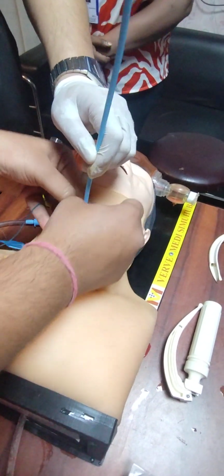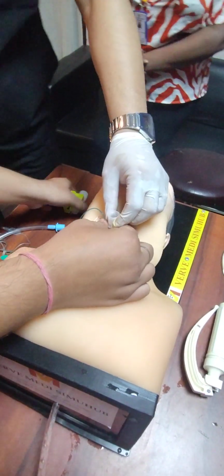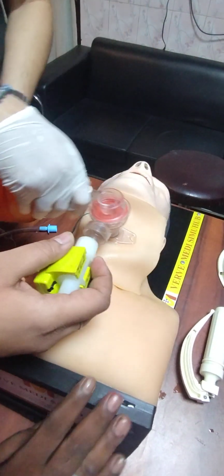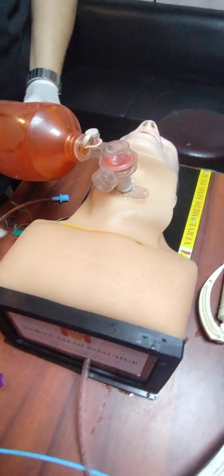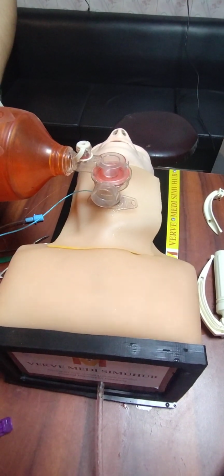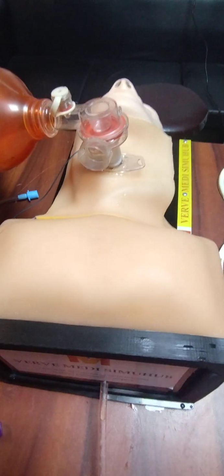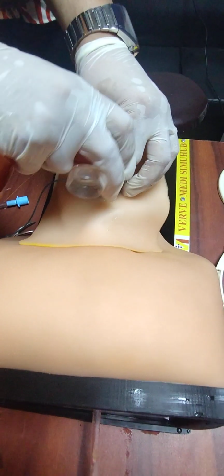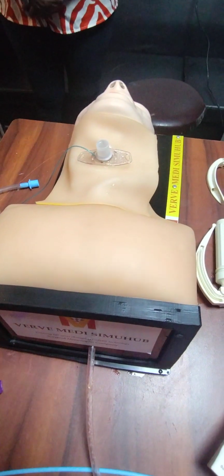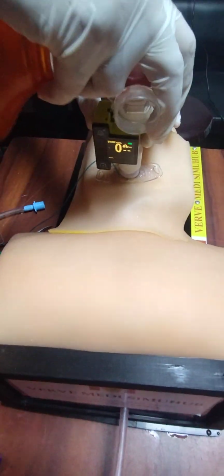Do it. Ambu, capnograph. Inflate the cuff. Inflate the cuff. So this is the chest rise. But before that, we want you to have that gold standard. I think we must start the culture of ETCO2 when we are intubating.